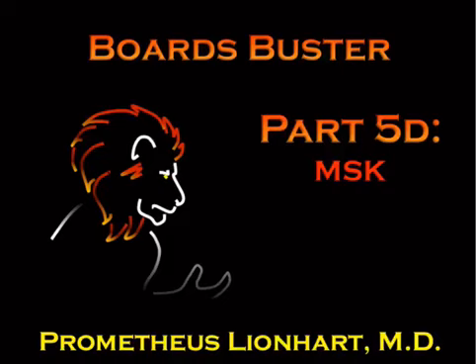Okay, so this is our MSK lecture that focuses on MR. A lot of people, depending on where you train, don't get a lot of MSK MRI exposure. Fellows tend to steal it all, so I'm going to make an attempt to cover everything that I think you need to know with regard to MSK MRI. It's a lot of just anatomy stuff, but I am actually going to go through and try to explain some of the more confusing topics and spend probably the most amount of time on the shoulder.